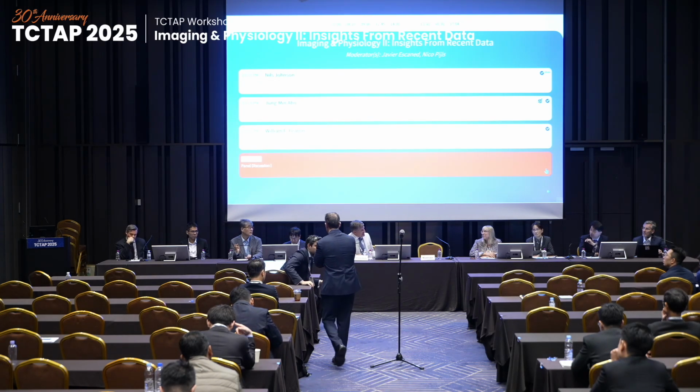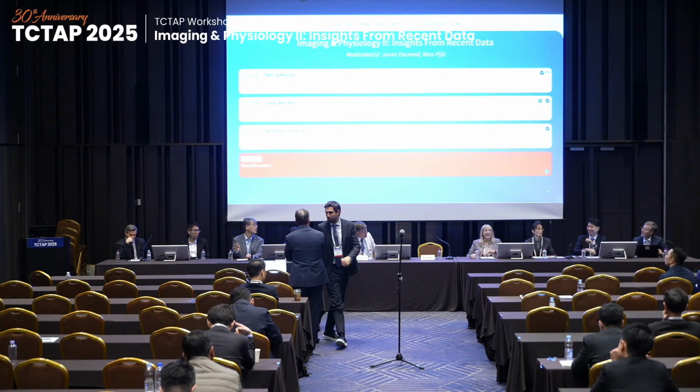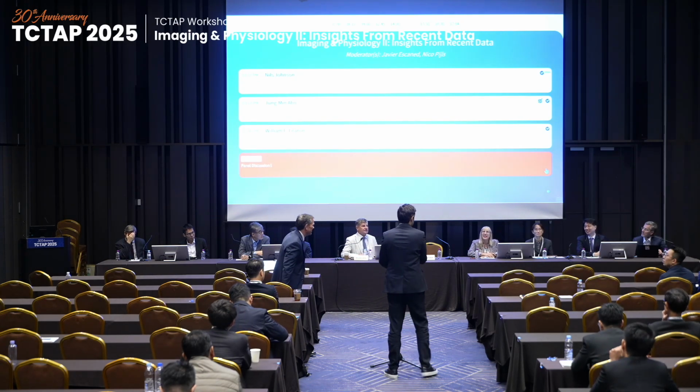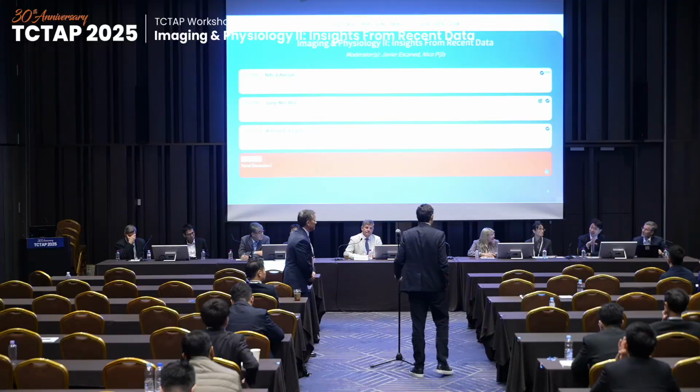Thank you. I'd like to ask, anybody else from the panel? Yes, please. Okay, I have one question to Dr. Beer. About the FAME3 study, did you check the post-PCI FFR? If not the post-PCI FFR, you can check the Angio-FFR also. Nowadays we believe in post-PCI evaluation of physiology. If you optimize physiology-guided PCI, that can give a better outcome compared to sub-optimized treatment. So did you analyze that?